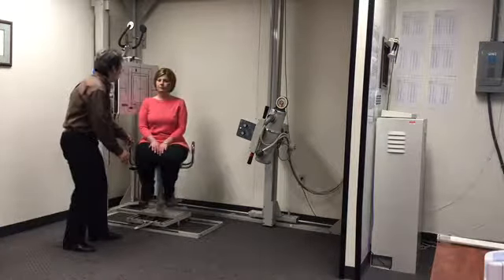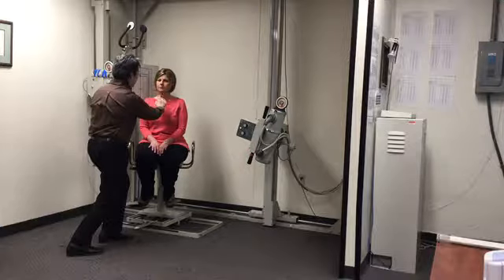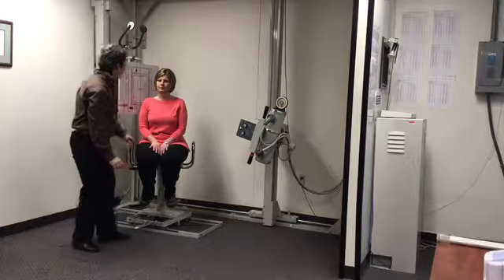And we're going to return to step 6, which is reestablish normal head carriage. Again, for her standard images, she would be marked at the chin and the episternal notch, and we would just bring her back in alignment with her normal head carriage posture in preparation for taking her next image.